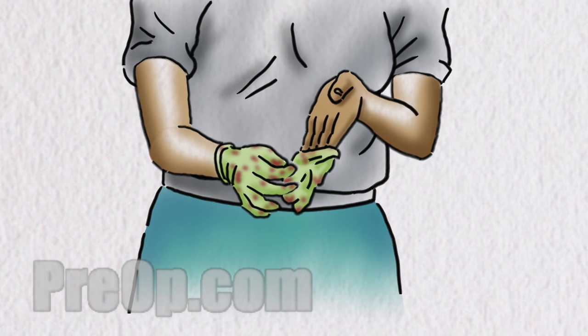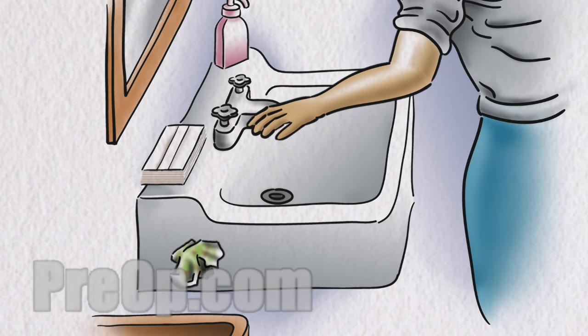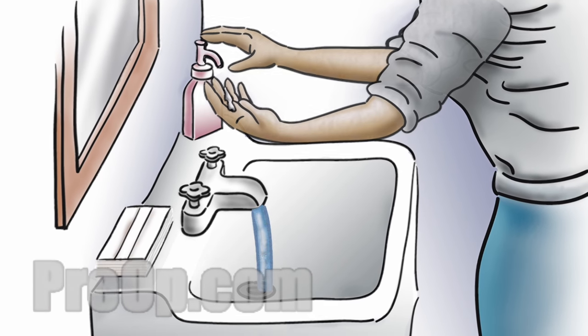When you are finished, remove your gloves and place in a trash container. Wash and dry your hands.